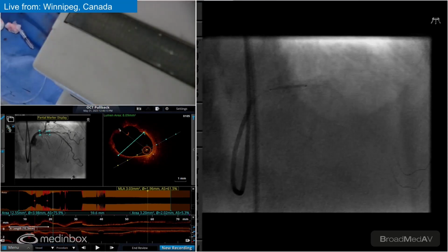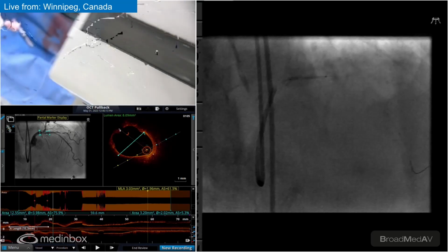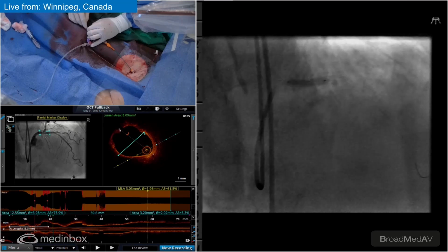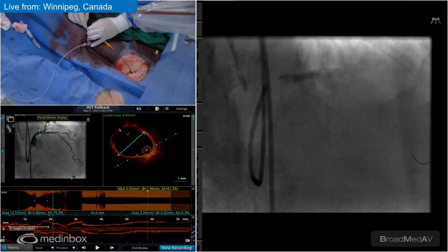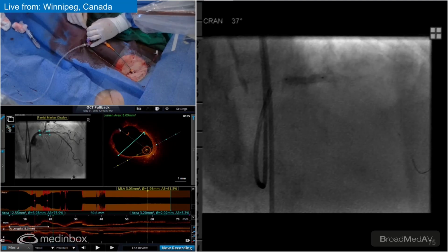Okay, let's go up. 2, 4, 6, 8. Up. 10, 12. Nice expansion. Yeah. The nodule at midnight to looks like 14. It's fighting you a little bit there. Yeah. Let's keep it at 14.